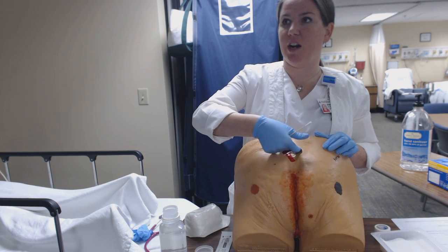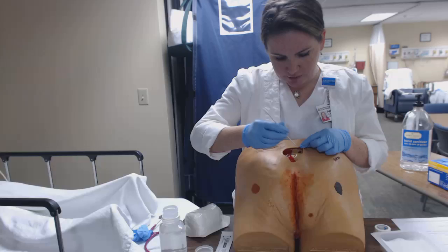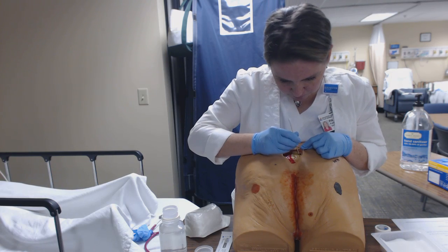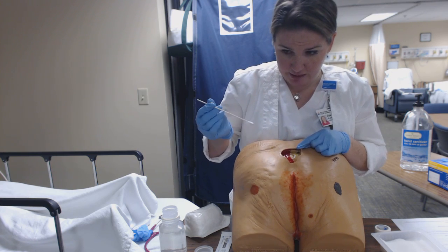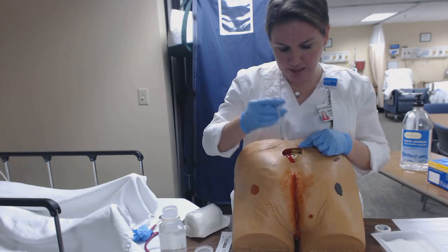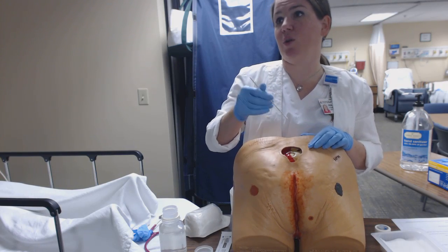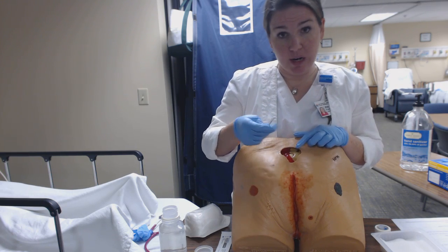So I've run my finger and I kind of caught the tunneling here at 1 o'clock. So I'm going to measure it. I took this side because this was too wide to measure my tunneling. And I don't want to, of course, jam or force anything into the wound, so we don't want to make it worse.